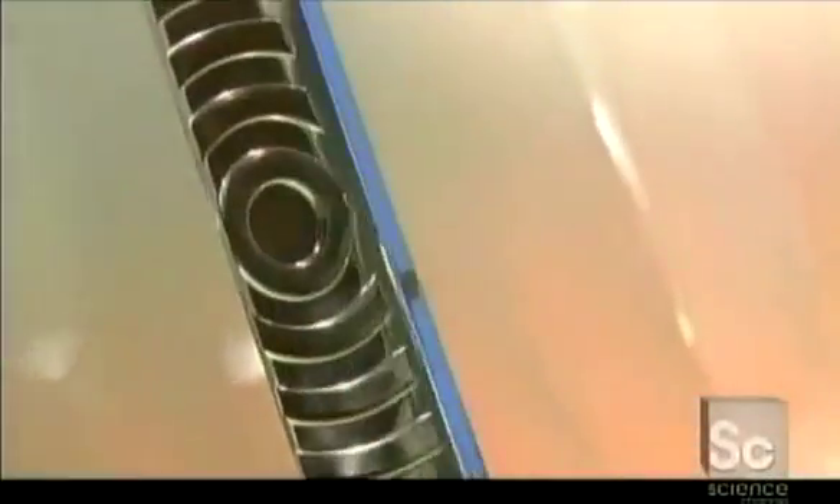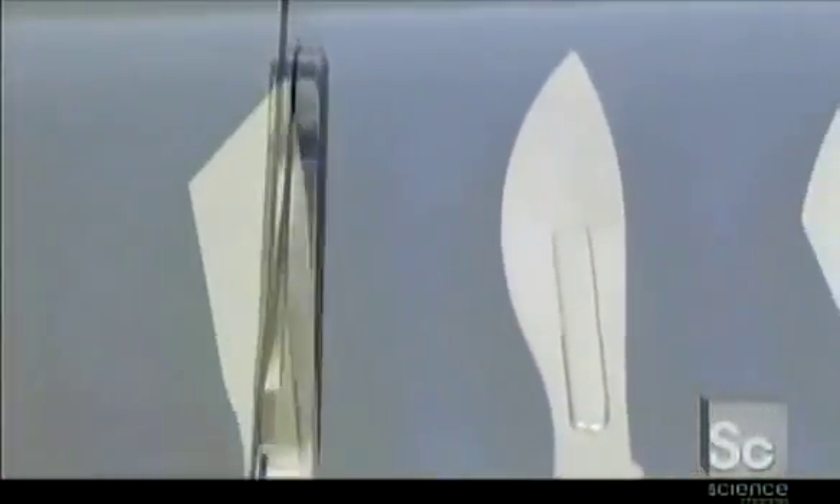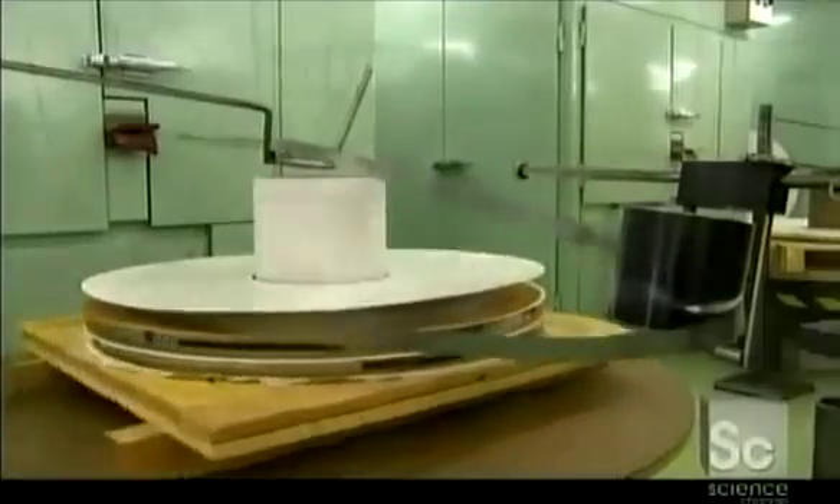Scalpel handles are made from rods of stainless steel. The blades are made of either carbon steel or stainless steel. They're sterile and designed for one-time use only. The blade steel is extremely thin — less than two hundredths of an inch — and it arrives at the scalpel factory in coiled strips.